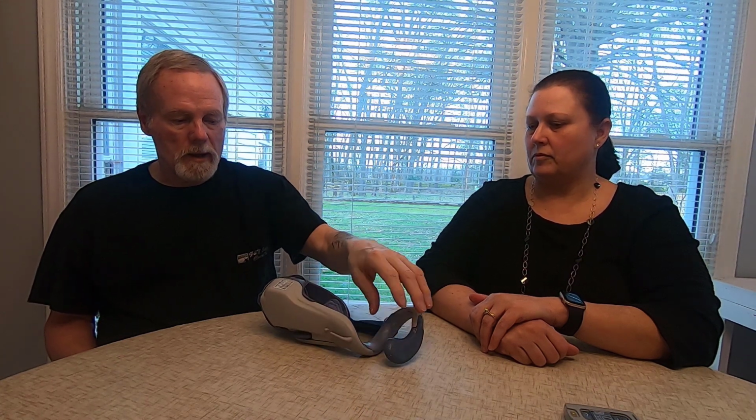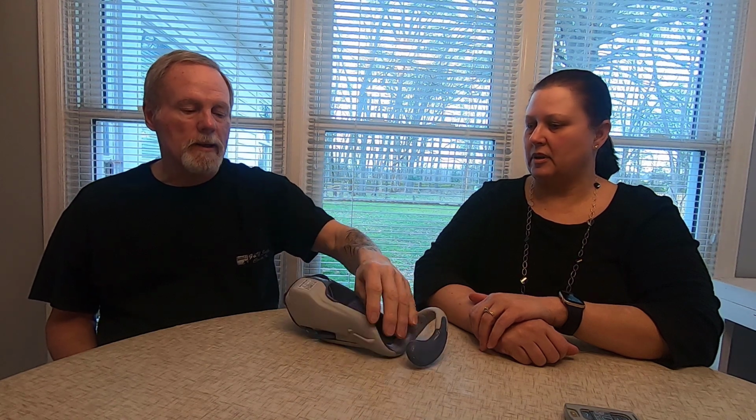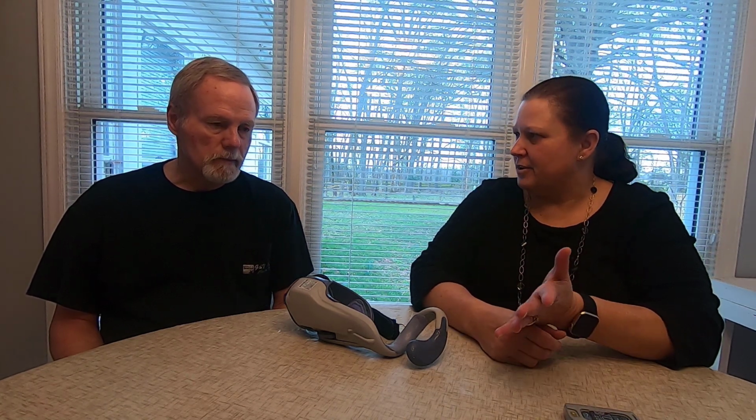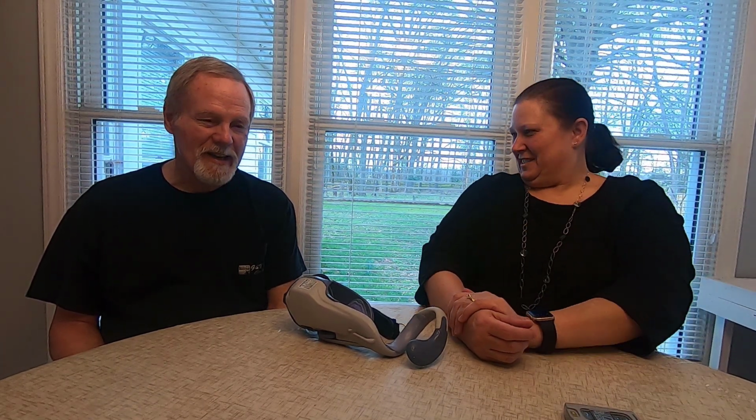And we put that on, and it kind of puts my hand through there and under there, and that goes on my wrist, and it gives electric waves to my hands. It helps straighten out my fingers and stuff. So it actually makes his fingers move while he's wearing it. What's it feel like when you're wearing it? Like you're getting shocked. So not really fun. No, it's not fun.